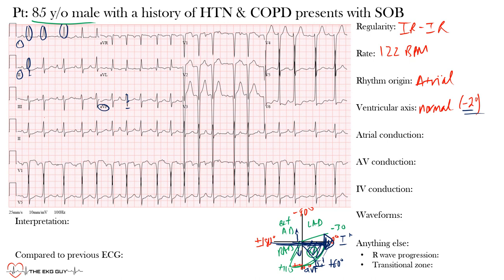For atrial conduction, we look at leads II and V1. P waves are present in both leads but have multiple different morphologies. Importantly, the criteria for assessing atrial enlargement — whether right or left — assumes sinus rhythm is present. Since sinus rhythm is not present here, we cannot comment on atrial abnormalities. Therefore, atrial enlargement is indeterminate.